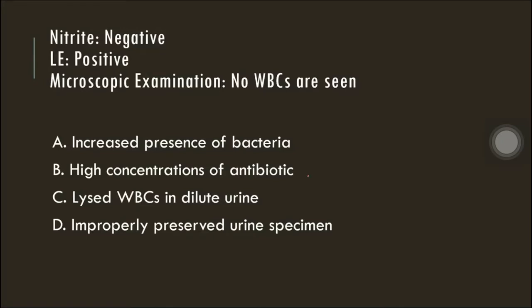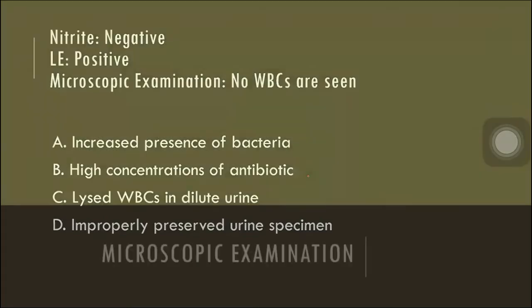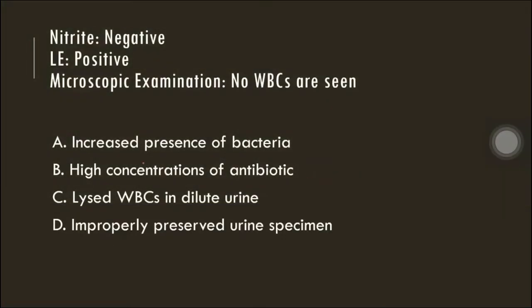Okay, so in this case, the answer is letter C. Lysed WBCs in dilute urine.